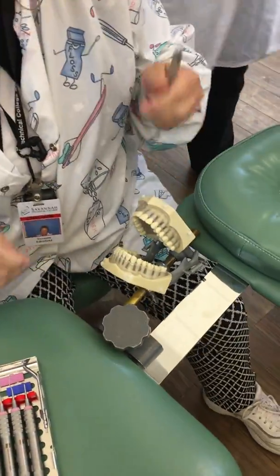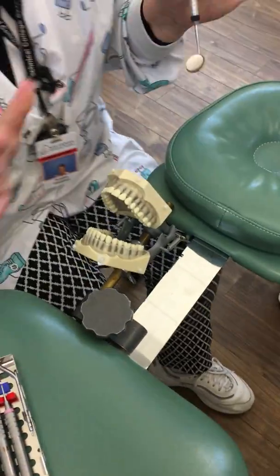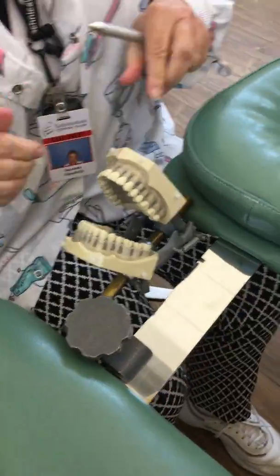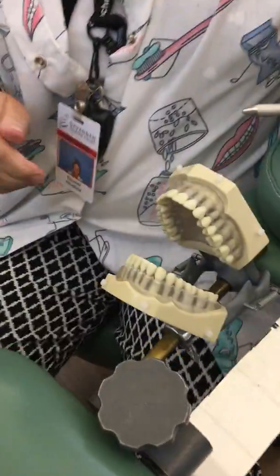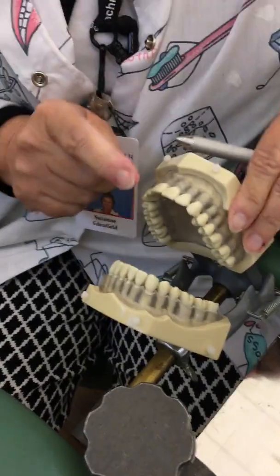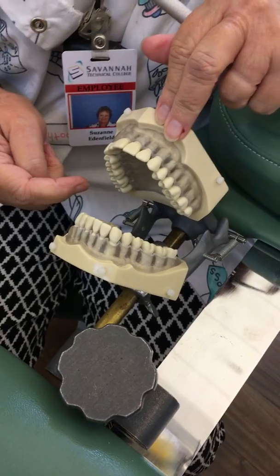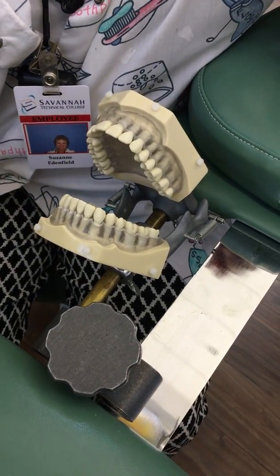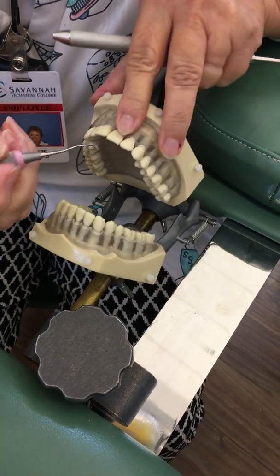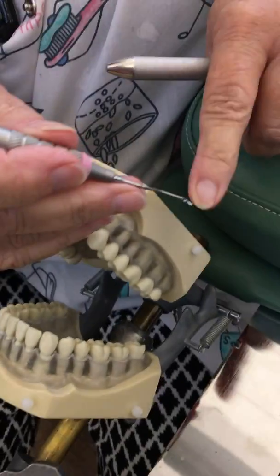We're going to move on to the maxilla now, and everything you've learned up to this point remains the same — operator position, patient position. Remember we did areas with the Explorer one through four from the 11:30 position, so we're going to maintain that and go to our anterior Gracie.